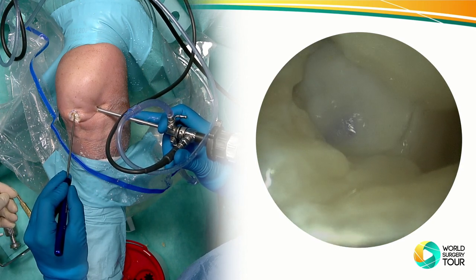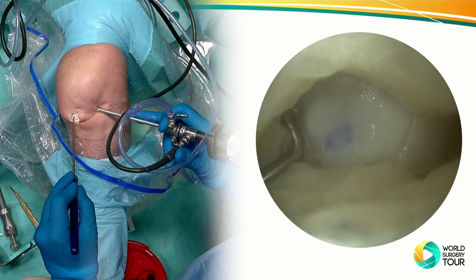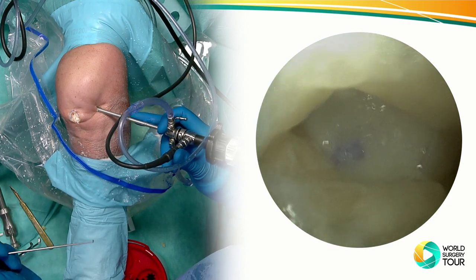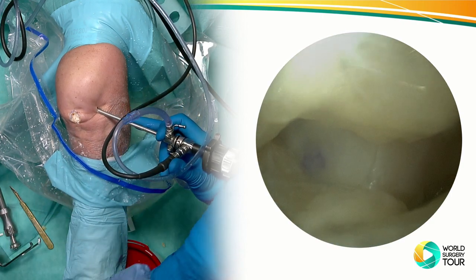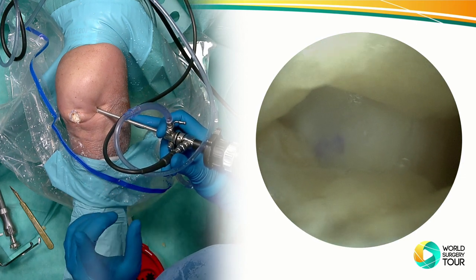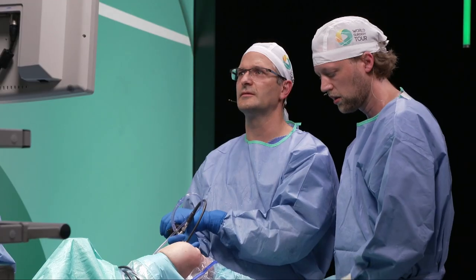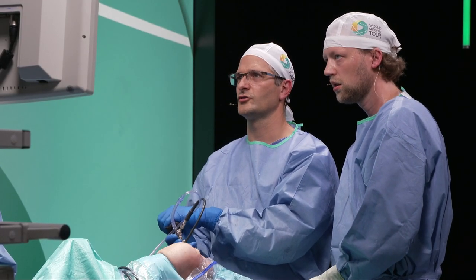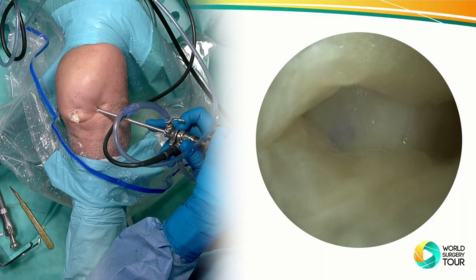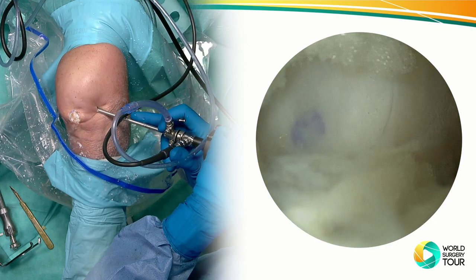You can see the edges fit perfectly together. Because that's always the case if you use a curette, then the cartilage shoulder doesn't fit perfectly with the membrane. And in this case, it really looks perfect. Wait a second, let me turn on the water and the vision might be a little nicer. But that should obviously withstand. Let's put a little water there. Expand the whole thing.